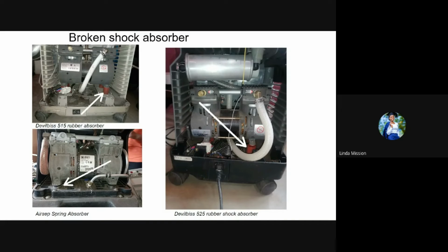The compressors begin to make hissing and cracking noises that are irritating to bear if a concentrator with broken shock absorbers is used for a long period of time. So the images in the graphics again are showing different shock absorbers in three concentrator models.